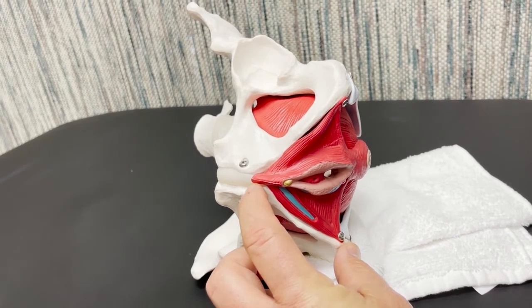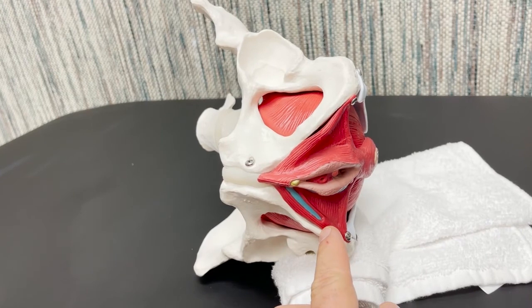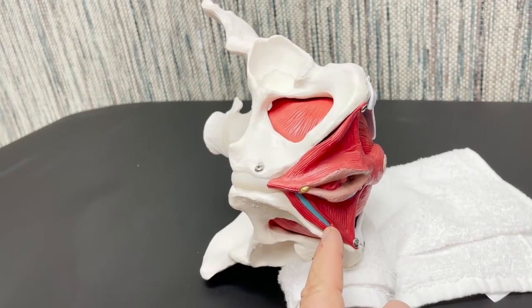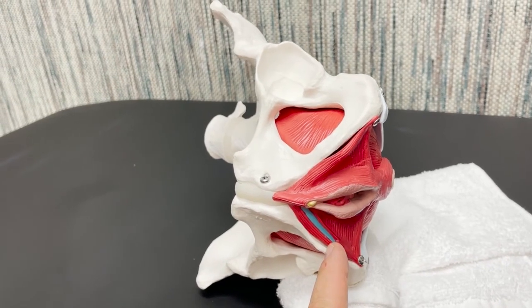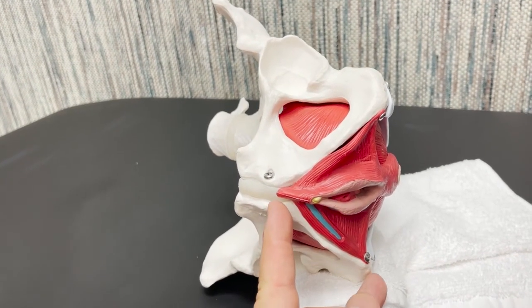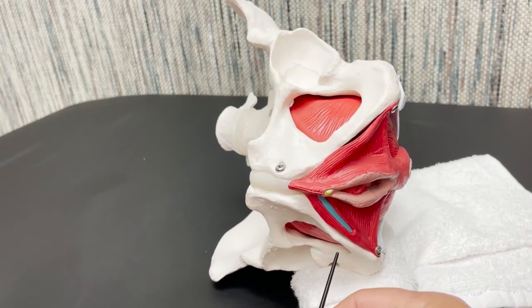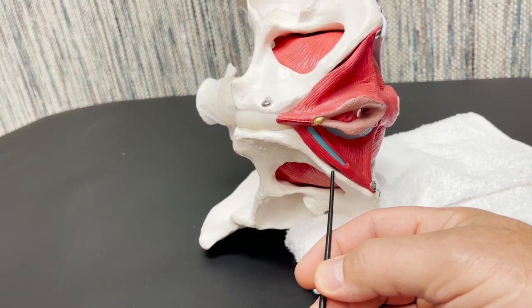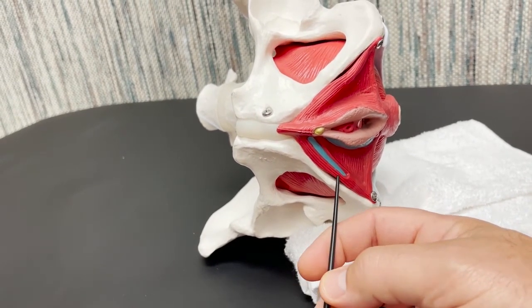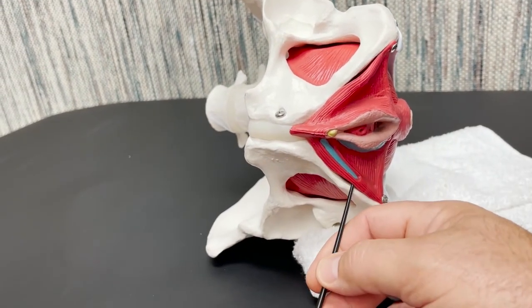Needle location will be at the midpoint between these 2 points on the ramus in the female, and it's going to be directed medially and posteriorly 45 degrees on a tangent to the ramus. So female ischial tuberosity, pubic symphysis at the midpoint, we're going to needle 45 degrees posteriorly to ensure that we needle into the ischio-cavernosus right here.